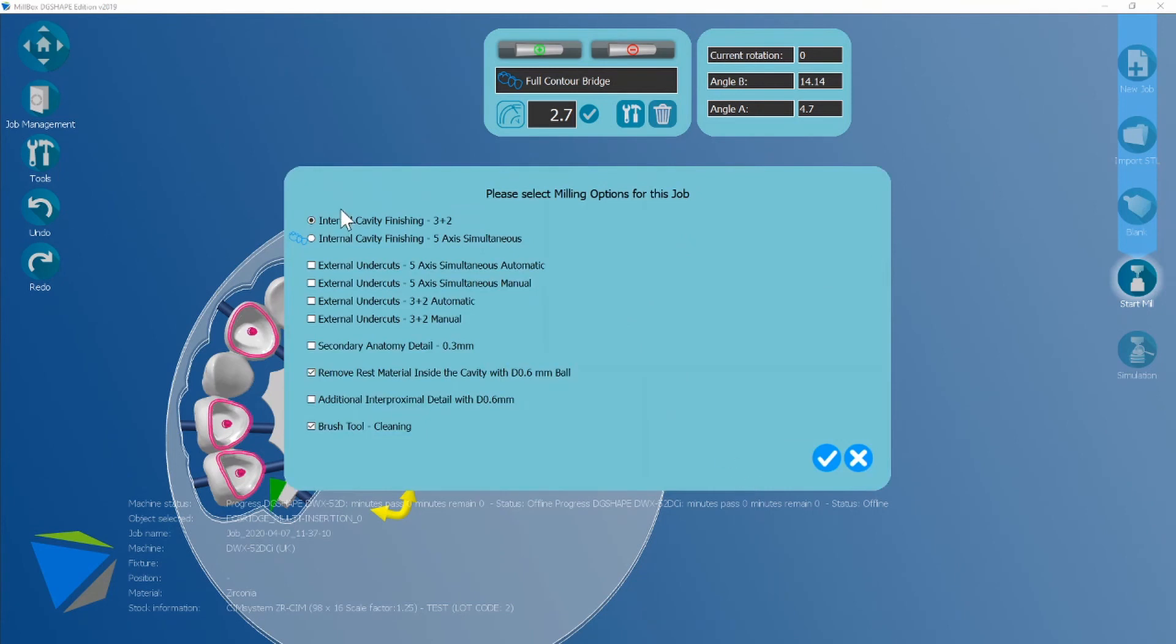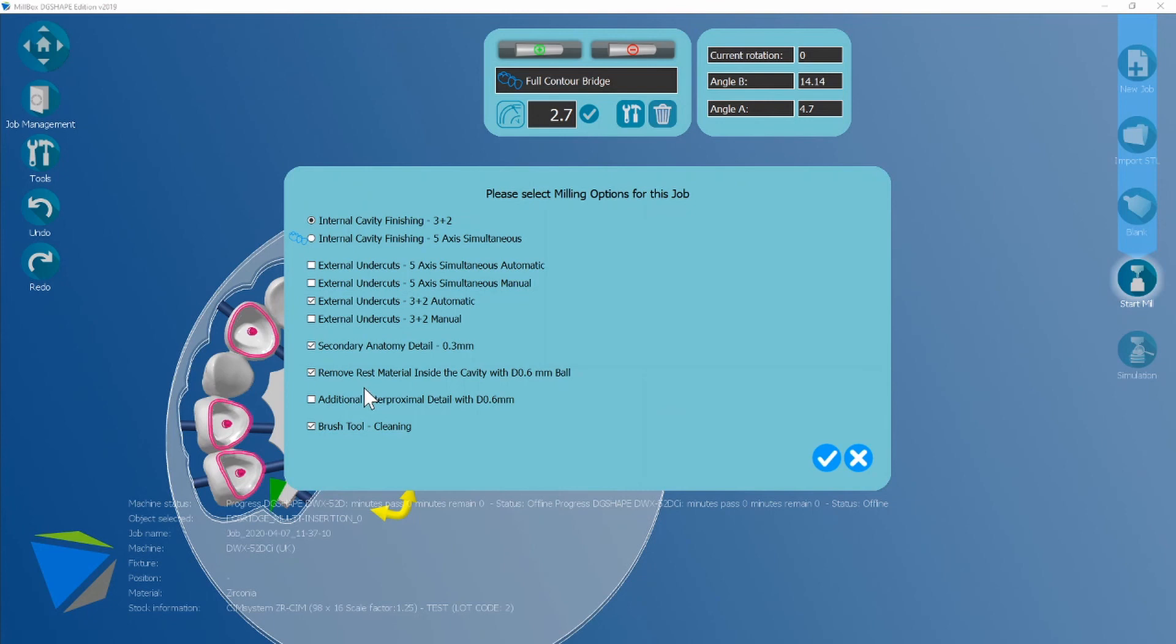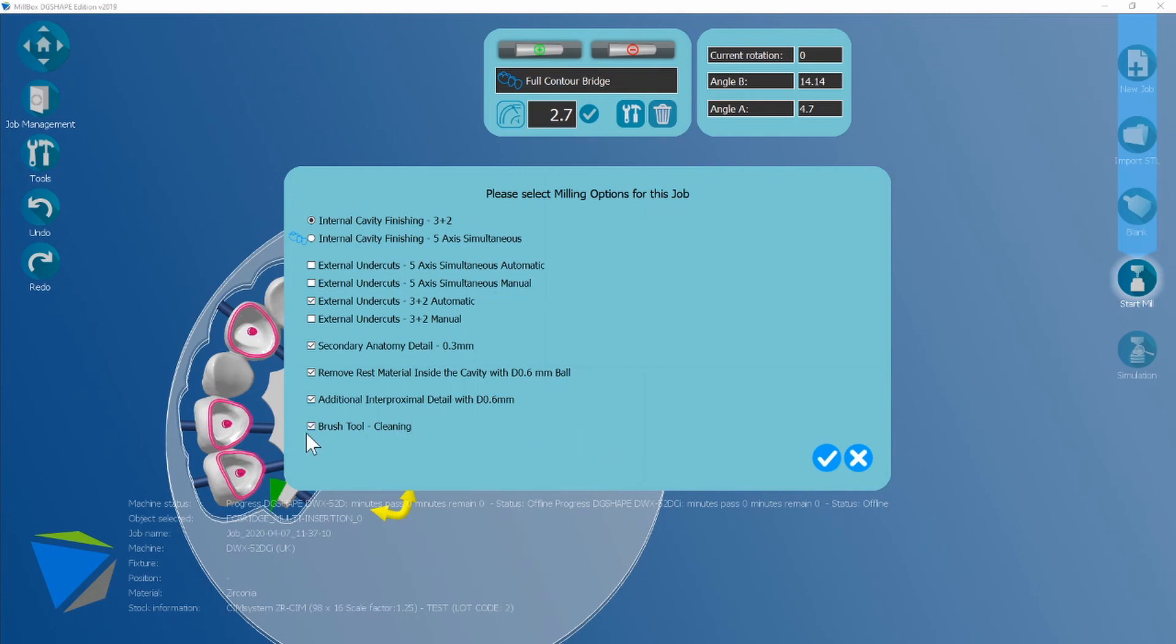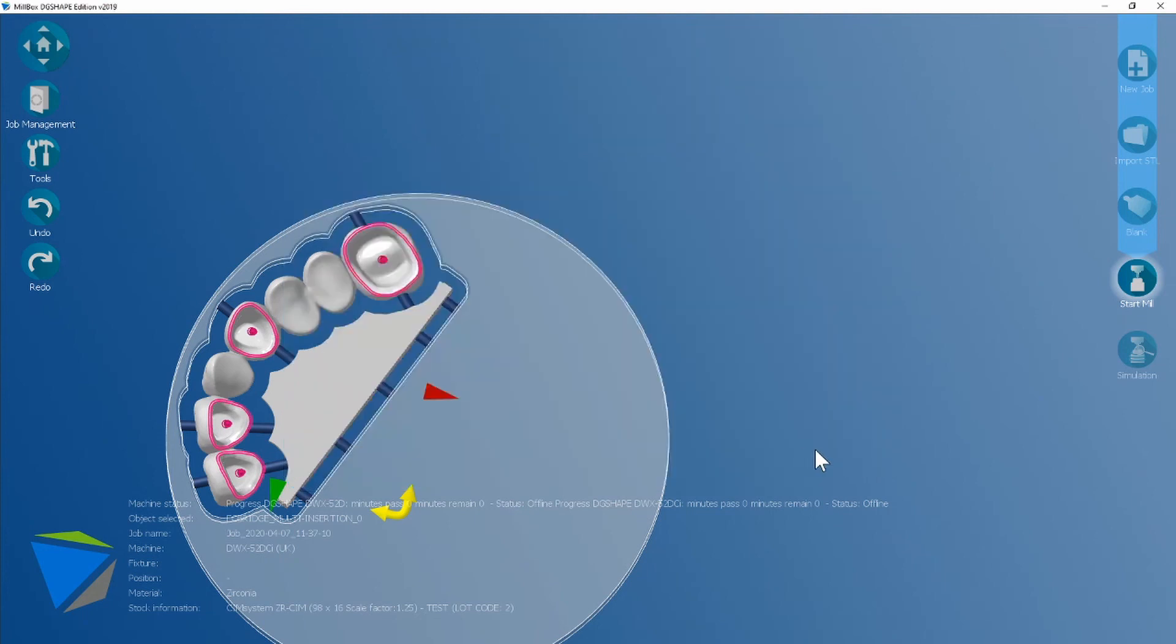And you're going to get the same milling options as you did in the crown workflow, but with a couple of other additional choices. So we're going to go back to the 3 plus 2 automatic. We're going to turn on the anatomical detail of the 0.3. You can still get the rest material inside the cavity. And the additional interproximal detail of a 0.6 is new for a bridge workflow. So we're going to turn that on to get the best result we can. And then the brush tool is going to stay on because it's zirconia. Next.